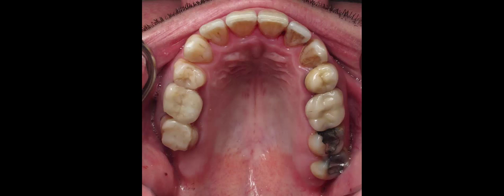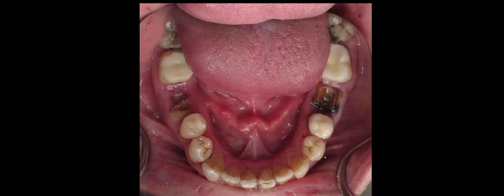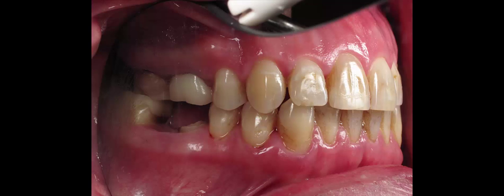On the upper jaw, one crown fell off and broke. It's going to need to be replaced also. And here's a good view of the lower wisdom teeth, which are decaying, and the two root canal teeth that are broken.